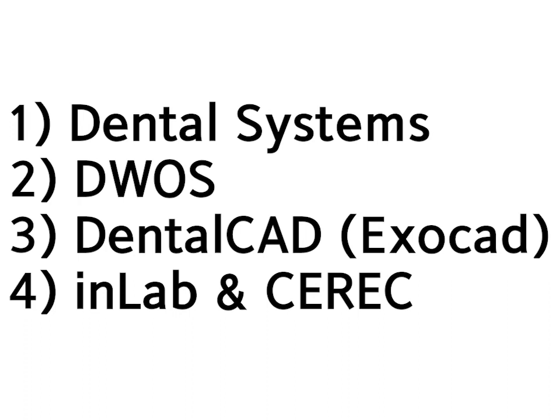The next one is the Dental CAD. This software was created by the exocad company, which was founded in 2010 as a spin-off company from the Fraunhofer organization. The software was developed for dental technicians, and it has a wide range of indications, functionalities, and work modules. With the standard version of exocad Dental CAD, the lab technician can design anatomic crowns, anatomic simple copings, attachments, bridge frameworks, inlays, onlays, veneers, wax-ups, and telescopic crowns.